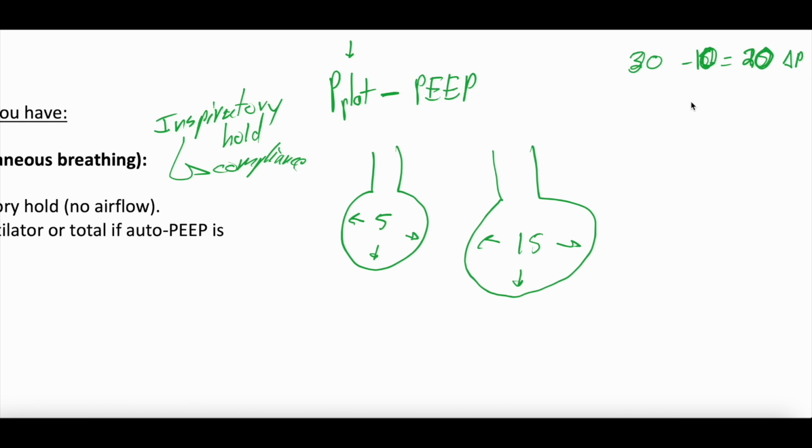And we're going to draw an alveolus if you're watching the YouTube video, and that alveolus is here, okay? And let's say we're like, goodness, is this the right amount of PEEP? Could they be under-distended, under-recruited, or over-distended, over-recruited? And I think, based on my clinical assessment, that they are under-distended, right?